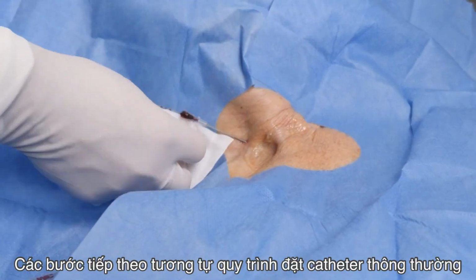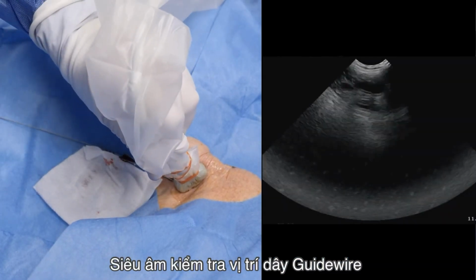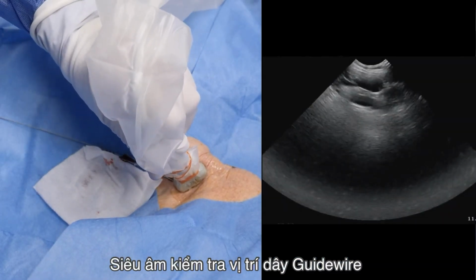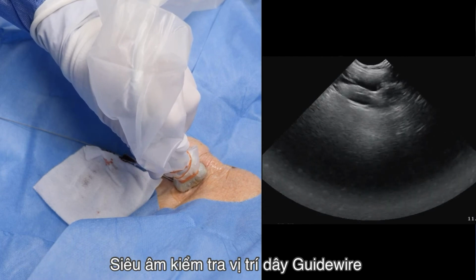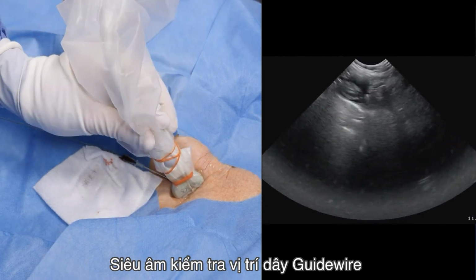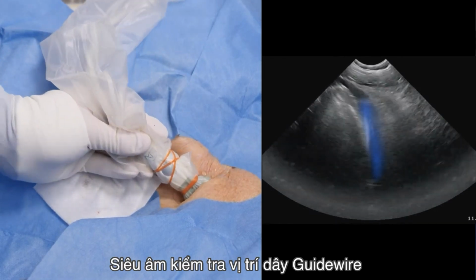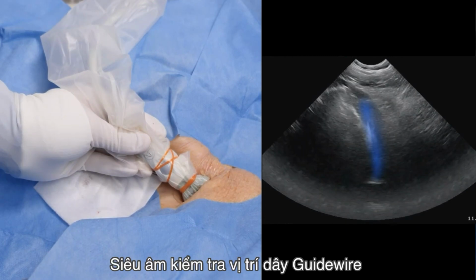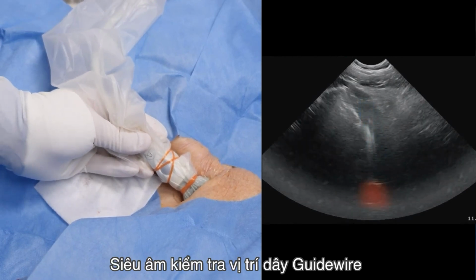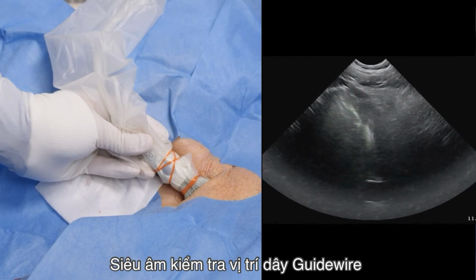Now confirm the position by increasing the depth to 10 centimeters and placing the probe along the short axis of the vessels. The guide wire should be seen as a hyperechoic dot in the IJV, here circled in red. Now tilt the probe caudally and follow the guide wire as it descends towards the superior vena cava, marked in blue. An adequate depth has been achieved when the tip reaches the level of the pulmonary artery, marked in red. Be sure not to confuse the guide wire with the hyperechoic pleura of the right lung, marked in green.